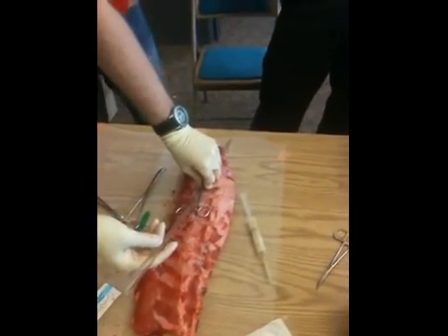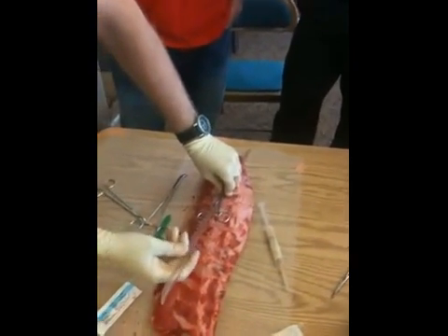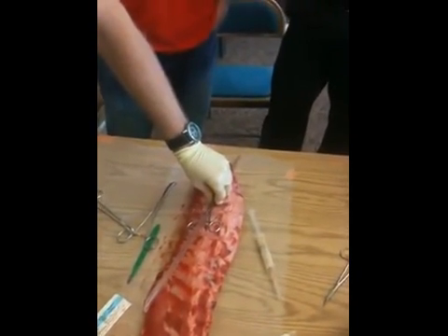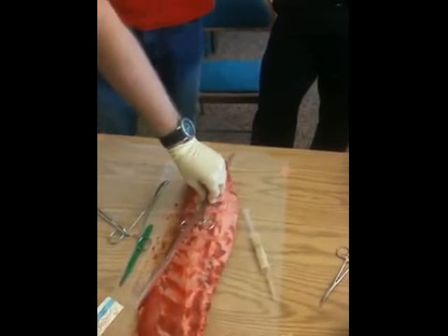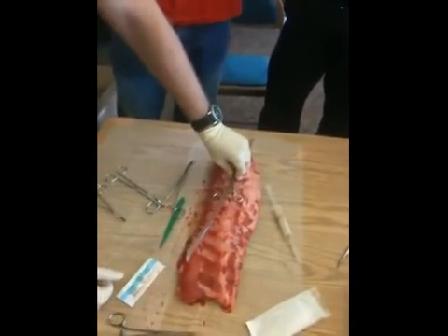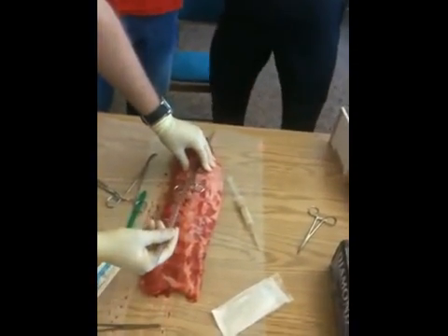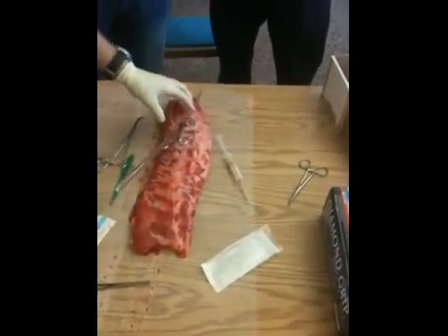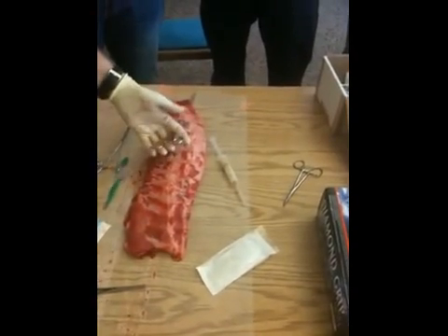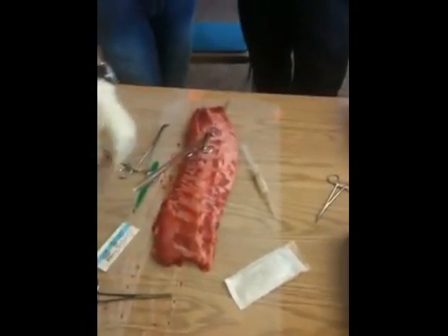The ones we fly with are really nice because it's a dry seal and can maintain up to 20 centimeters of underwater pressure. Then go ahead with your dressing and mark it so people know you used a towel clamp. We'll talk about the suture techniques when I open this stuff up. That's the basic procedure for inserting the chest tube.